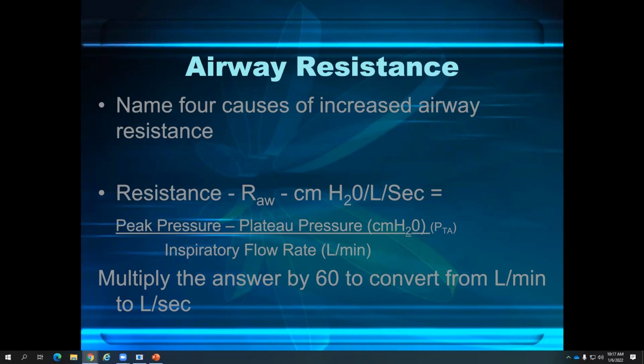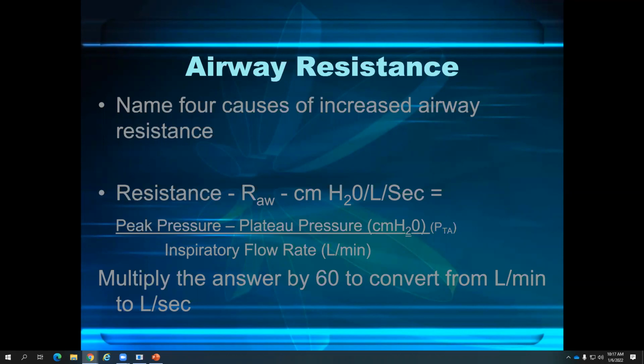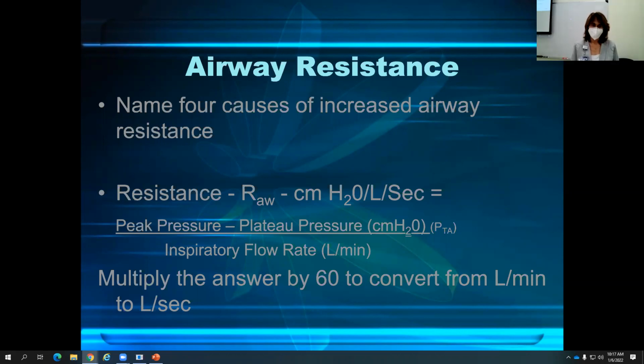Small endotracheal tube and very fast flow of air into the lungs. Oh yeah, that's right. Good job. Thank you.